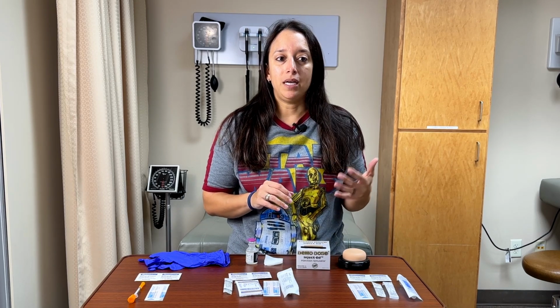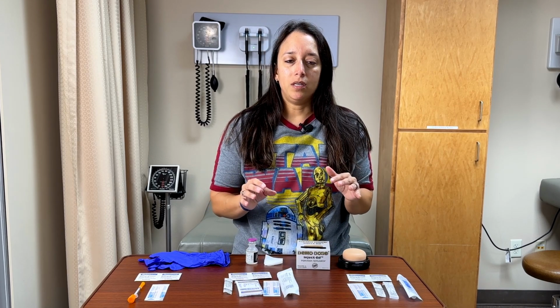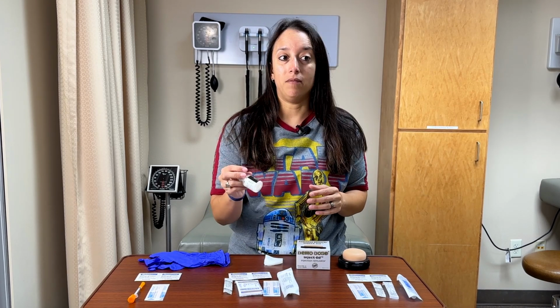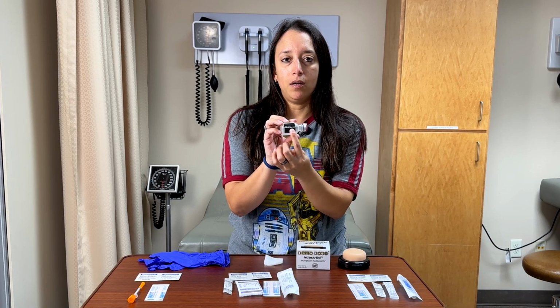Next, we need to review the medication. We need to check the strength and the dosage and ensure that it's the same medication that we're giving the patient as what we have in front of us. We also need to record the lot and the batch number, which are indicated right here.